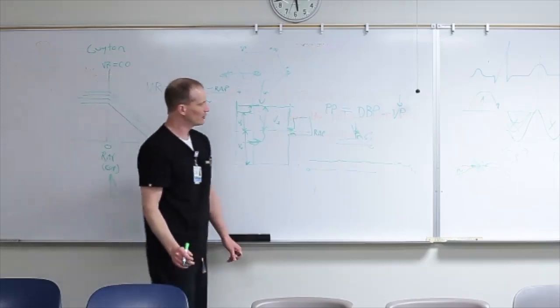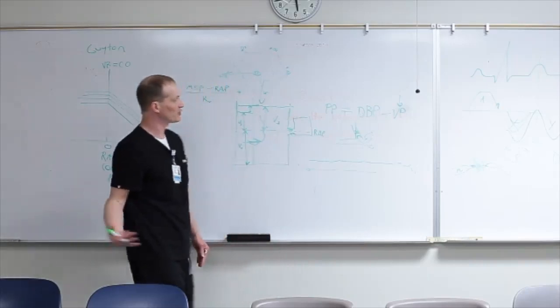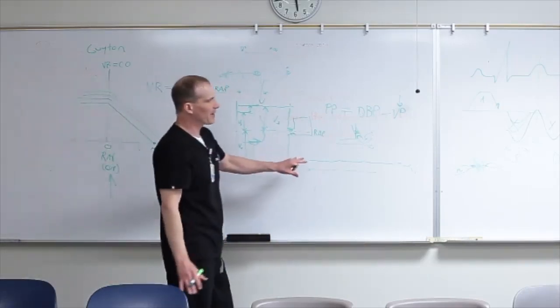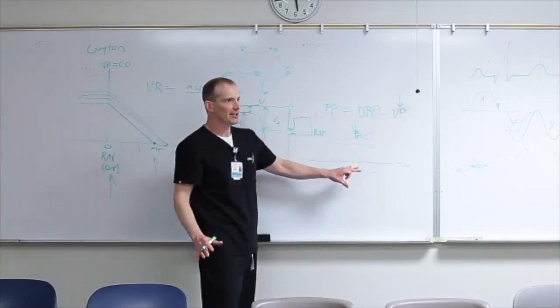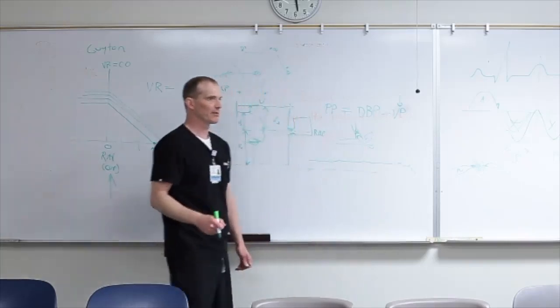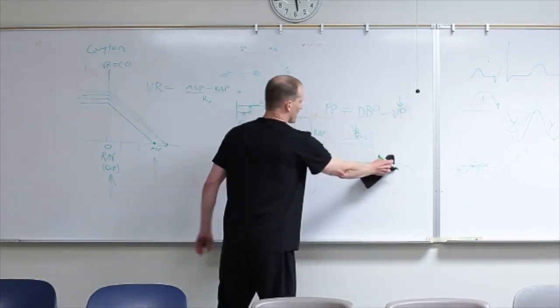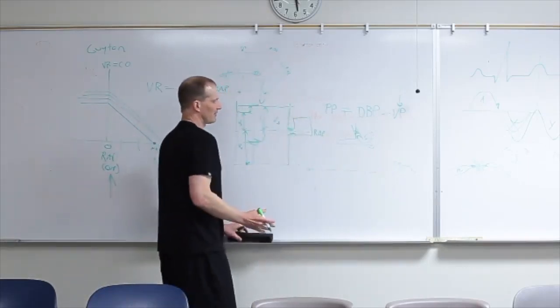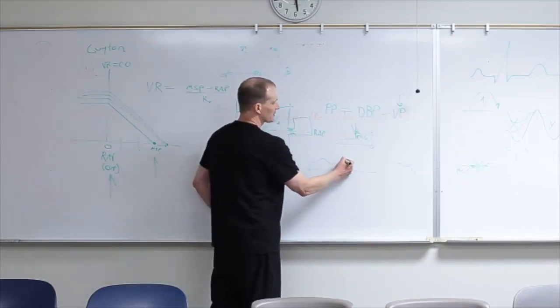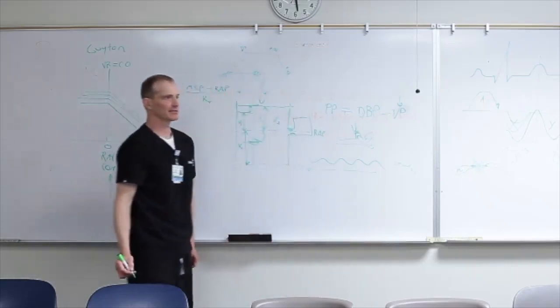And you'll know that if the portal vein is venous flow going to the liver, and you put the color box on it, it's going to be primarily just a red thing going towards it, if you've got your probe in the right position. As things get more and more pressure loaded and portal hypertension happens, it starts to get pulsatile. It's that red-blue thing happening.